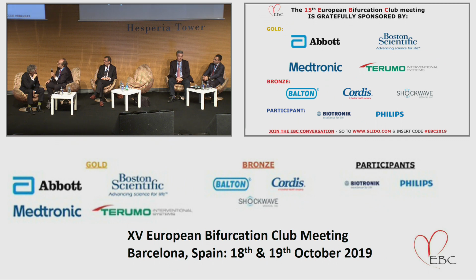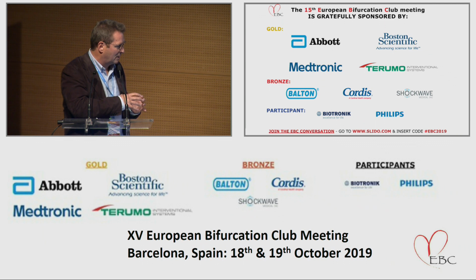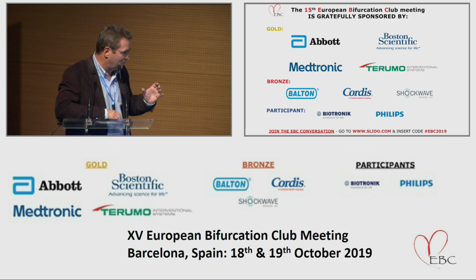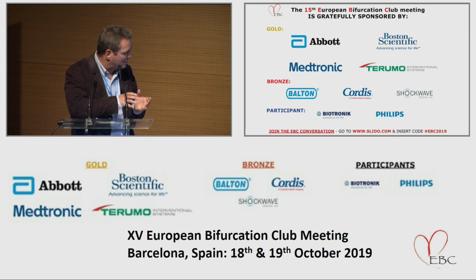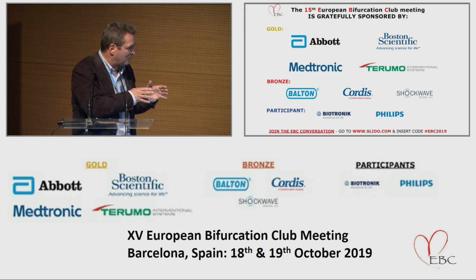Well, actually, most stents can go up to 5, yes, but you have to crack them and you have to overdilate them. I know that I overdilated this Megatron as well because it's supposed to go to 5. But of course you're right. It's the very big that is an advantage, and not only the very big, but also whether you have a big discrepancy between the distal diameter of the LAD or the circumflex and the ostial area of the LAD.